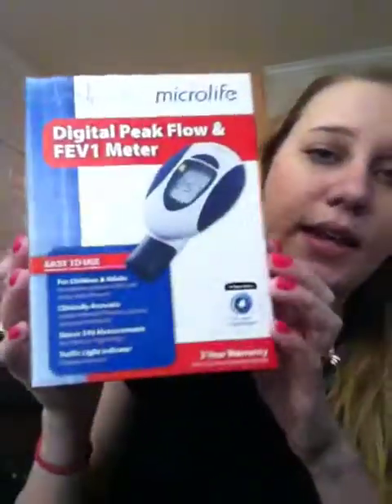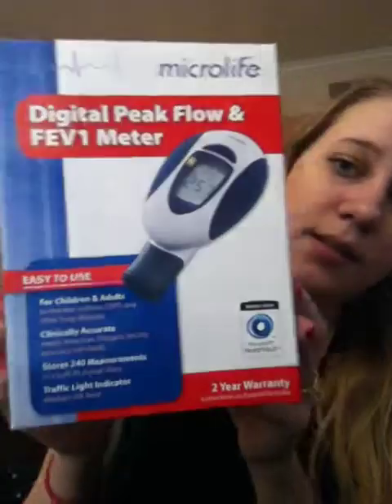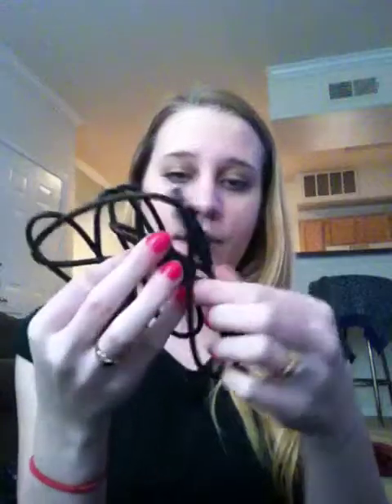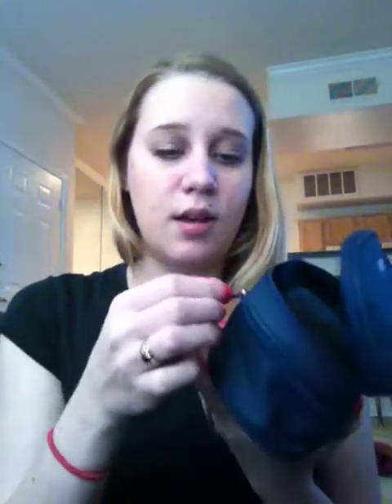It's the digital peak flow and FEV1 meter. The meter shows you how to use it and the buttons, and of course it comes with instructions. It comes with a little pouch, a top section with an information booklet, some little cards, and a USB cord that you can plug into your computer and into the machine. The big pocket comes with more cards and most importantly the FEV1 machine.